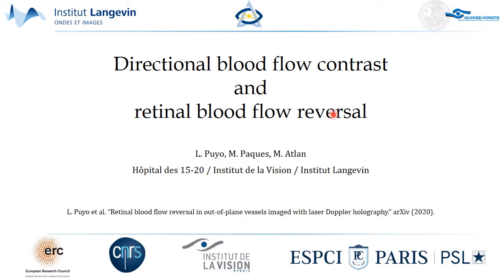Hello, I'm Leo Puyo, and in this video, I will talk about the directional blood flow contrast that we've recently introduced in laser Doppler holography and how we can use it to image retinal blood flow reversal. This work has not been published yet. It's being reviewed, but it's currently available on arXiv.